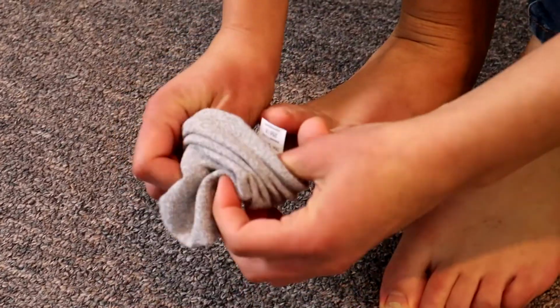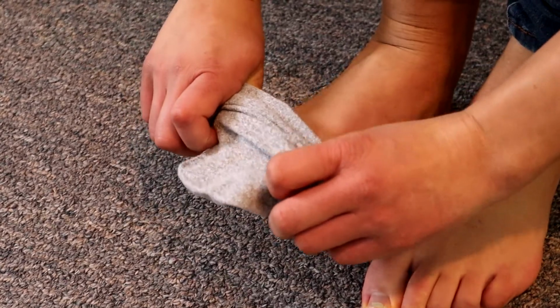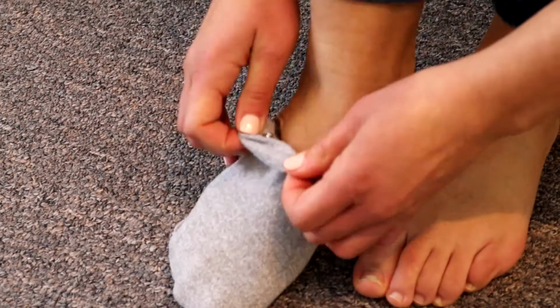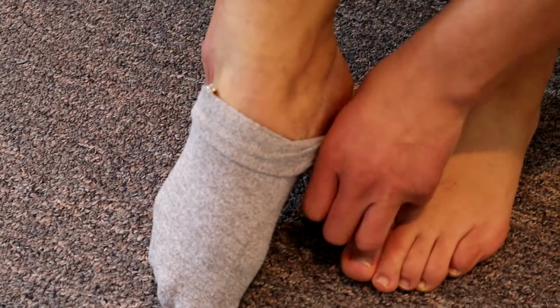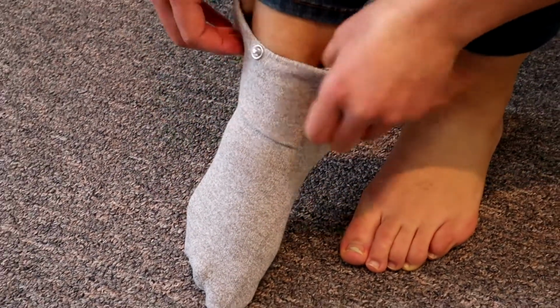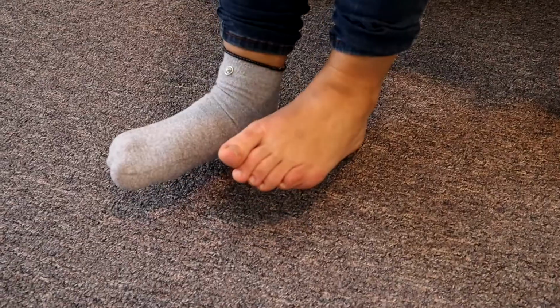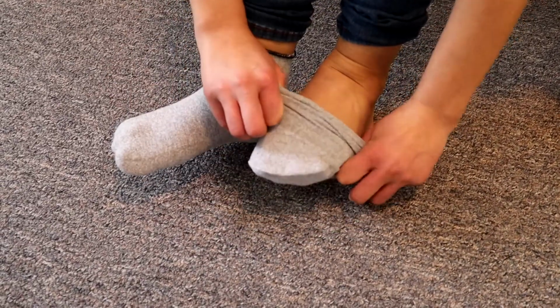Before treatment, we recommend washing your feet with soap and water. With the socks turned right side out, roll the socks onto each foot. To reduce stretching, try to avoid pulling the socks on. Repeat the process for the other foot by rolling the sock on.